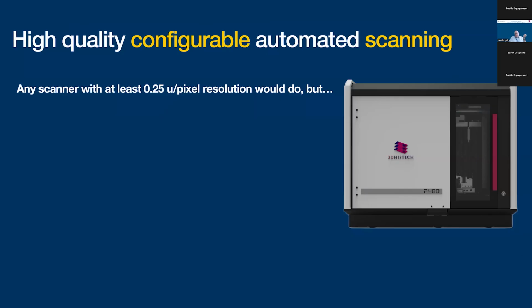It would be great, and everything is doable. But the important elements are coming for the marginal benefits. Everybody can do this type of scanning, but in terms of what your scanner would do if it fails to scan a slide? We have some scanners from a manufacturer which just stops, but we have other scanners which put the slide aside and continue with the work.